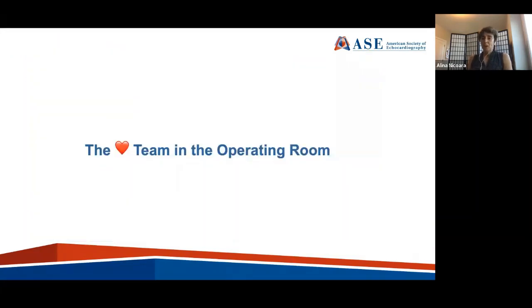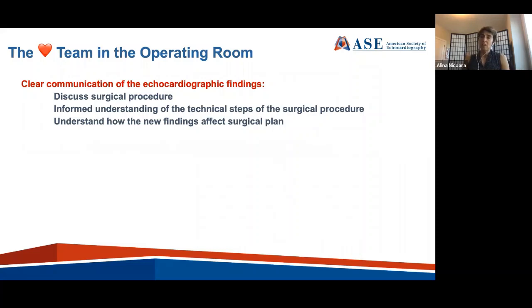So talking a little bit about the heart team, the concept of heart team in the operating room, it's very important to communicate clearly with the surgical team, and actually to speak somewhat a common language. So discussing the surgical procedure, it is important for us as echocardiographers to have an informed understanding of the technical steps of the surgical procedure, and discuss and understand how our new echocardiographic findings may affect the surgical plan.